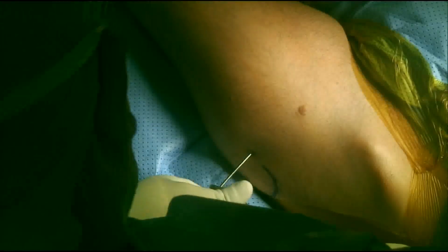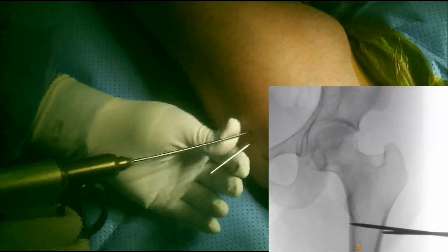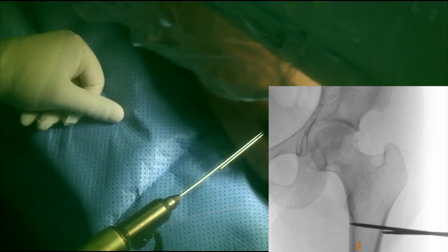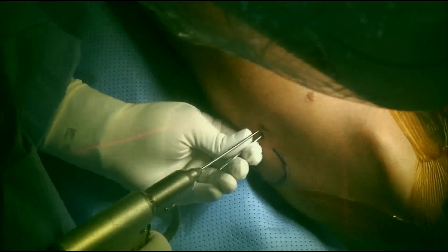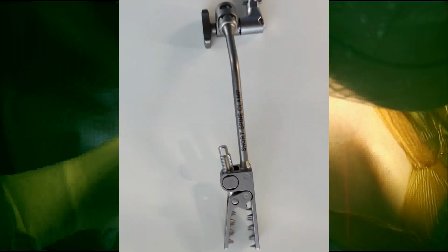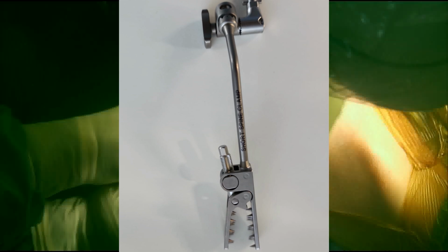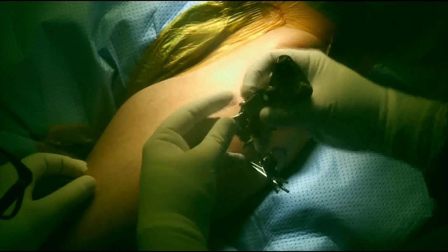From my experience, using a single wire might not be as good as using two wires next to each other. Using two wires gives more security and more stability for the patient tracker device. Although it is obvious that we should connect the tracking device to the bone of interest, which is the femur in this case, we don't recommend attaching the tracking device to the pelvis or to the tibia, for obvious reasons. Once we secure the wires, we attach the spinal clamp to these wires, and to this spinal clamp we attach our tracker system, and this will be identified to the navigation system as where the bone is attached to.